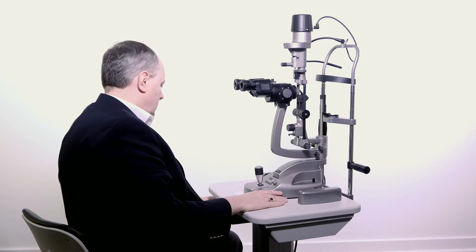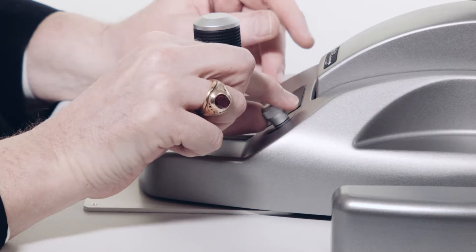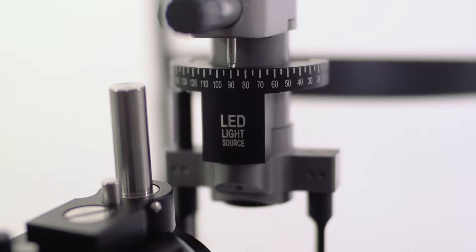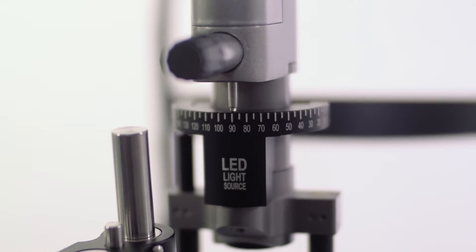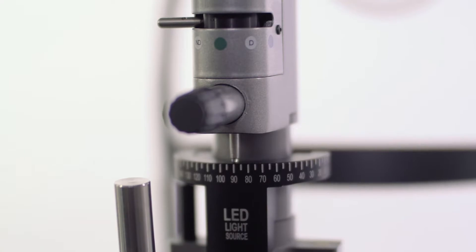Switch on illumination using the main power switch. Adjust illumination using the rheostat near the joystick. The K-Series slit lamp offers LED or halogen illumination.